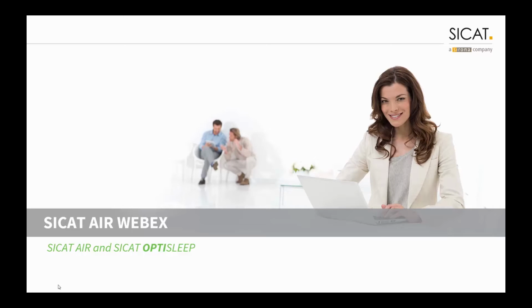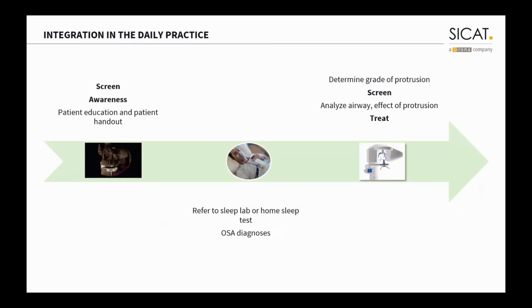Before I explain the SICAT software, I would like to show you how you can integrate the software into your daily practice. First of all, you have already either a scan of the patient, or you screen your patient the first time for the first consultation. With this scan, you can create awareness for sleep apnea or educate your patient by visualization of the airway. And last but not least, you can even give him a patient handout straight out of the software.